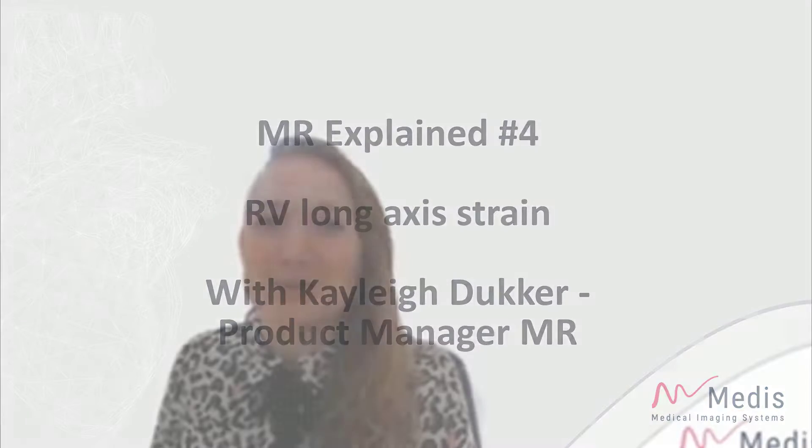Hi, welcome at the Medis with more quick tips. I am Kaylee Ducker and I am the product manager MR here at Medis. Today I will show you how you can do the right ventricle strain analysis.